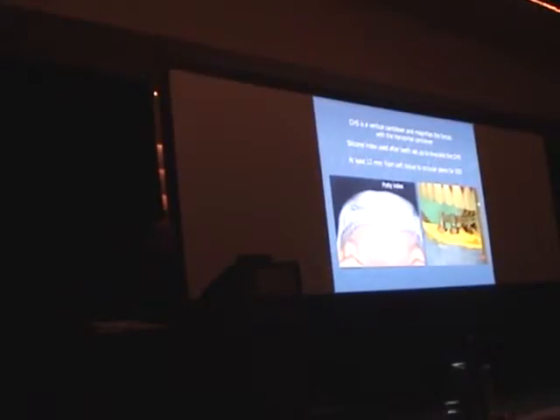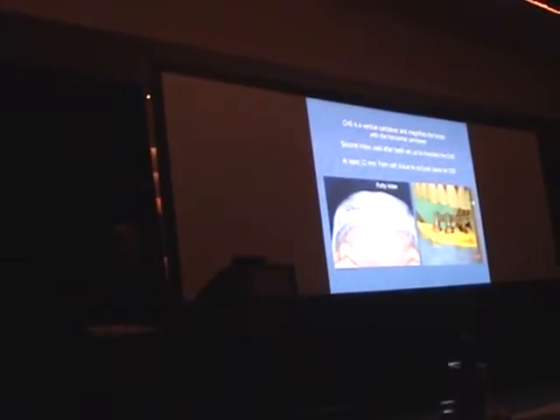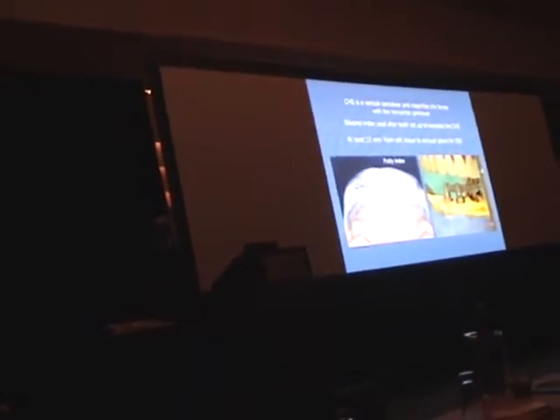Crown height space is a vertical cantilever and magnifies the forces together with the horizontal cantilever. A silicone index or putty index is used after teeth set-up to evaluate the crown height space. I usually make a first set of dentures for my patients, and then I get a putty index and evaluate this crown height space distance.